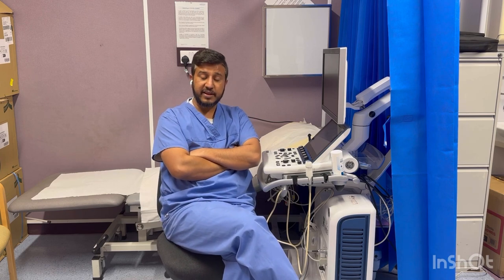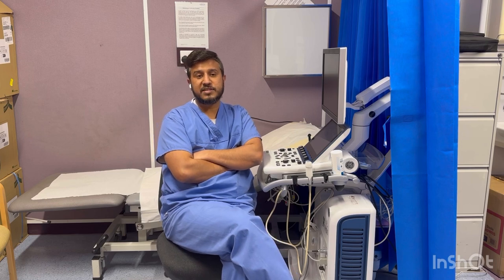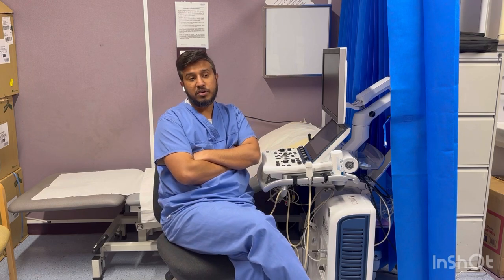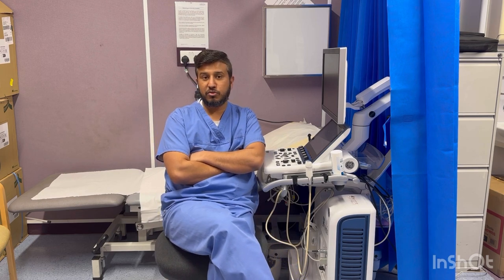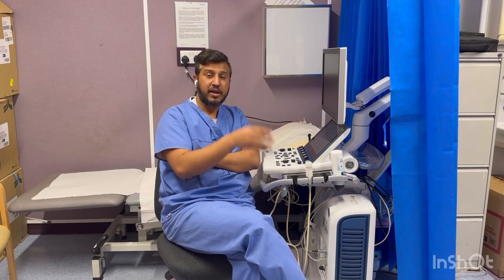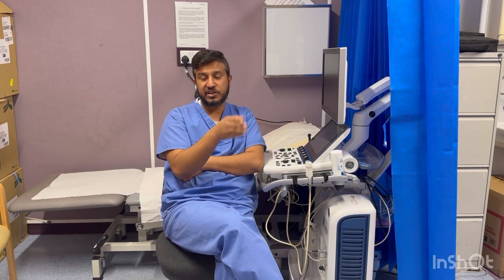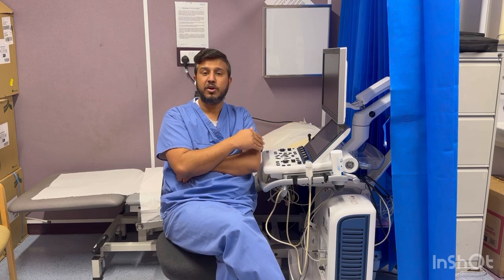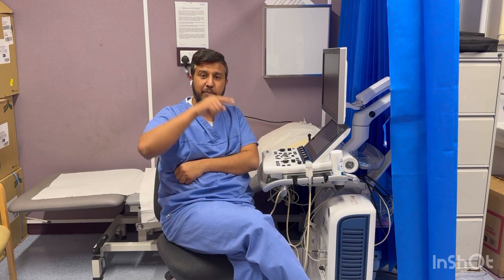The next technique is M-mode. M-mode stands for motion modulation mode. M-mode gives you a time-gated motion of underlying objects. You use a cursor in M-mode — once you put the cursor down, whatever object is coming under the cursor, it will give you the time-gated motion of that particular object.